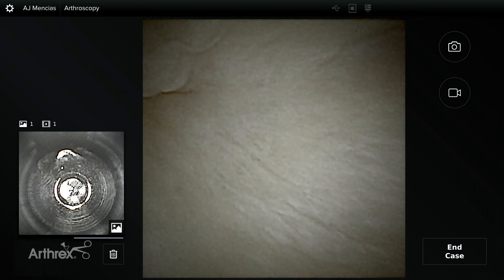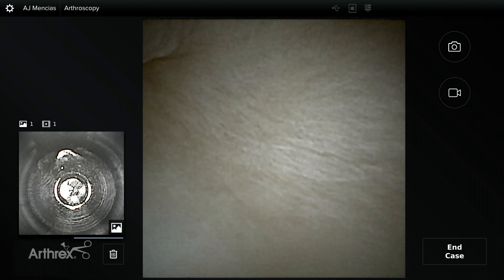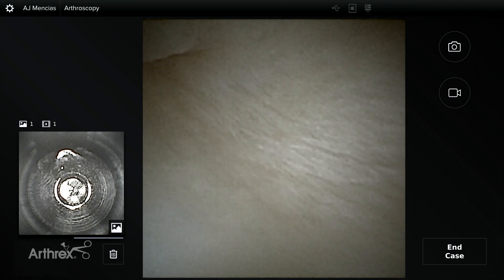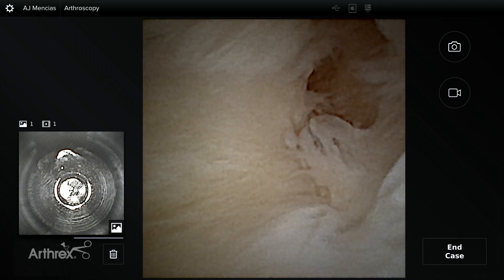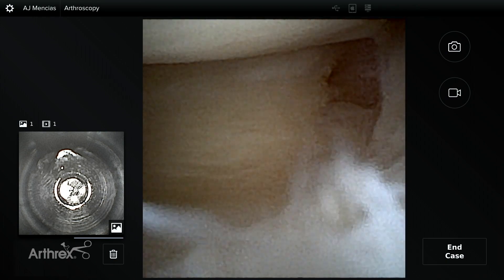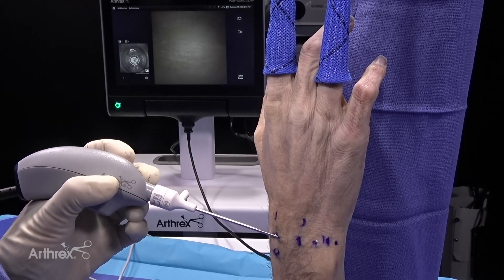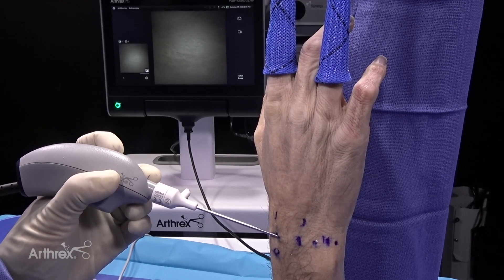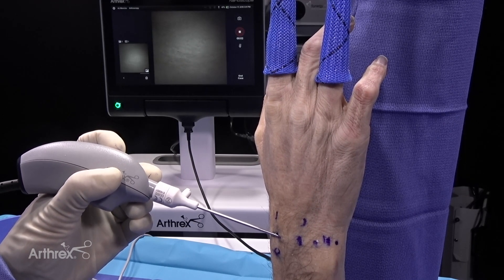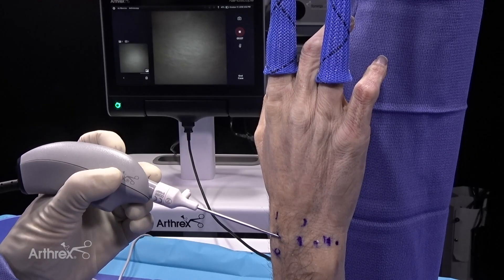Imagine using this nanoscope in the office or a procedural room. Sure you want to get an MRI, but I think this can tell you: is it torn radially, volarly, ulnarly, or dorsally? In this patient there may be a central articular disc tear which I have in the middle of the field. I have the ability with this ergonomic handle to take a picture with one button, and I can take live video as well — the video capture is on and I'm turning it off right now.